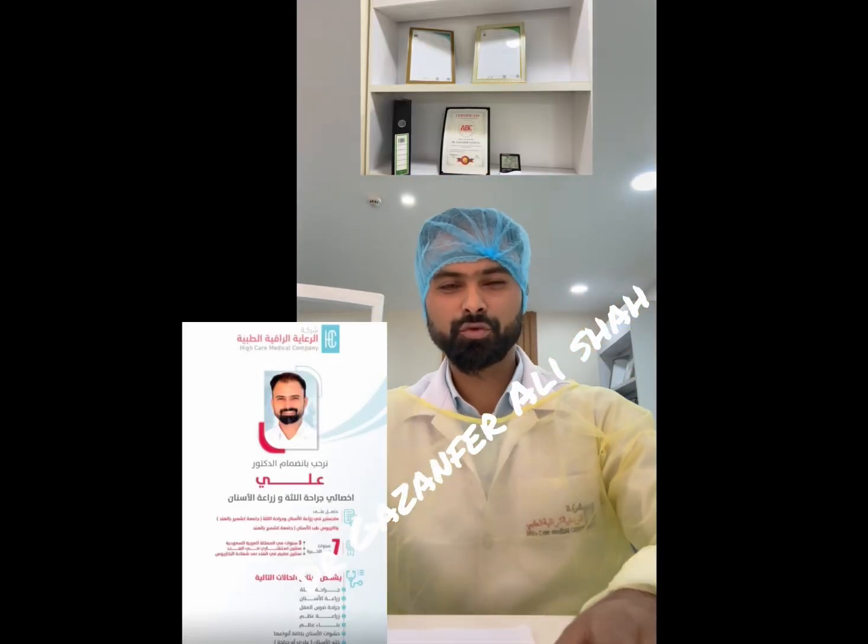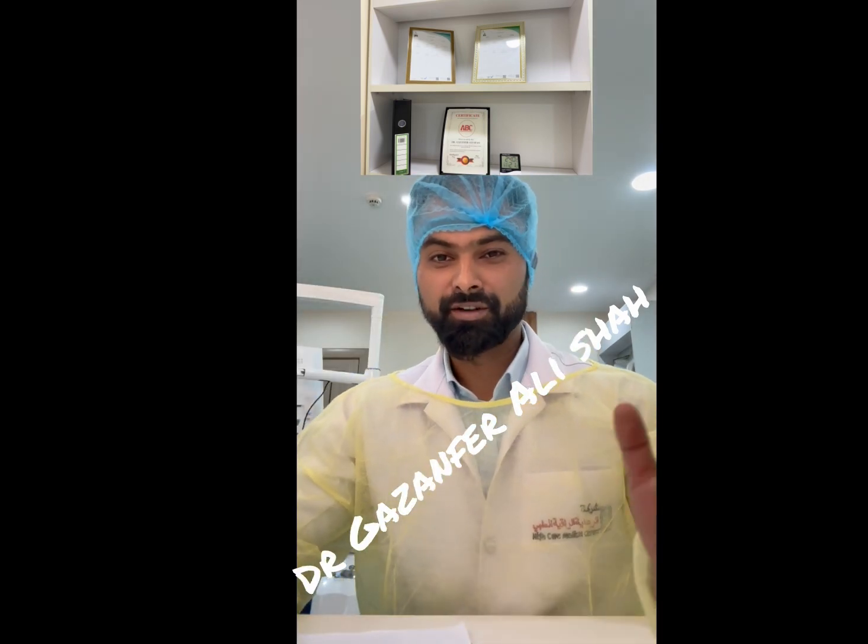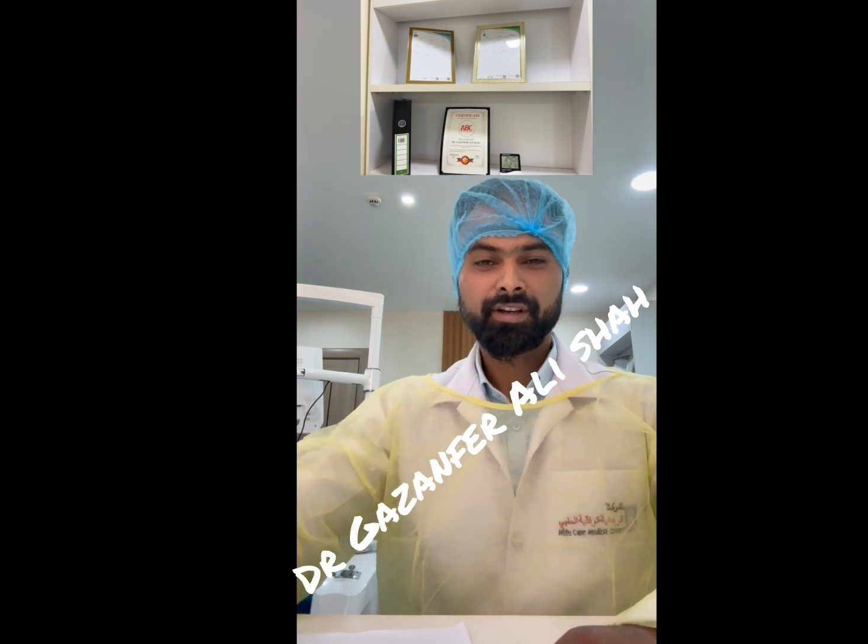Today I'm discussing with you one dental implant case. If you're considering tooth replacement, this guide will help you in making an informed decision regarding the same.